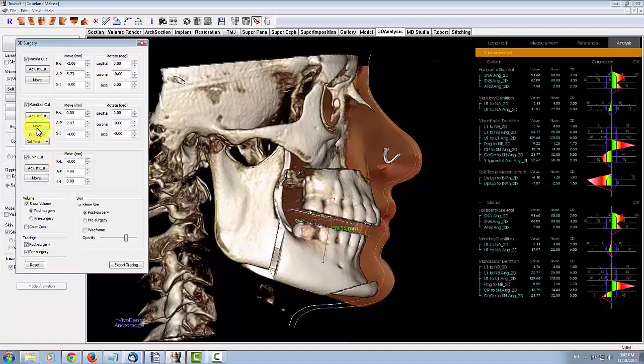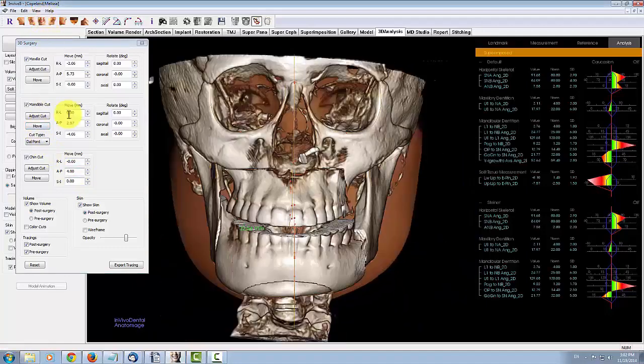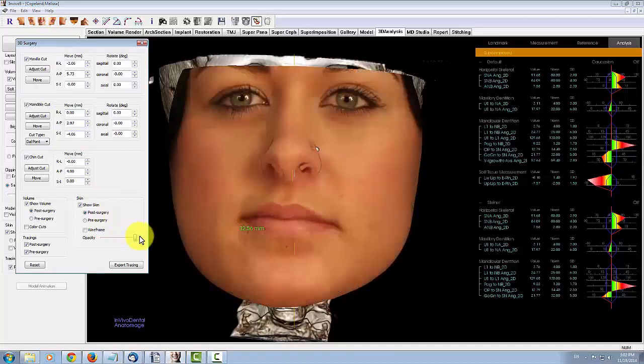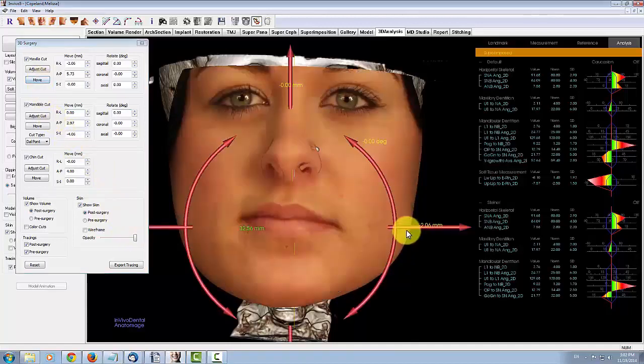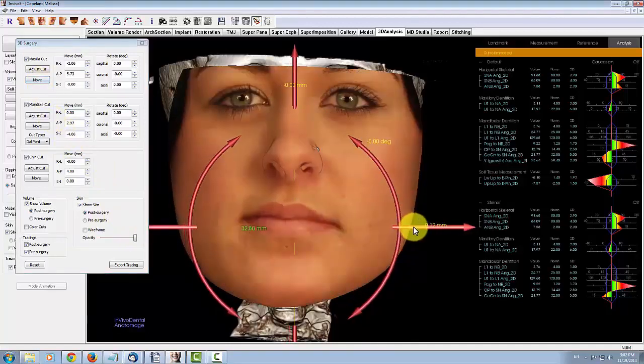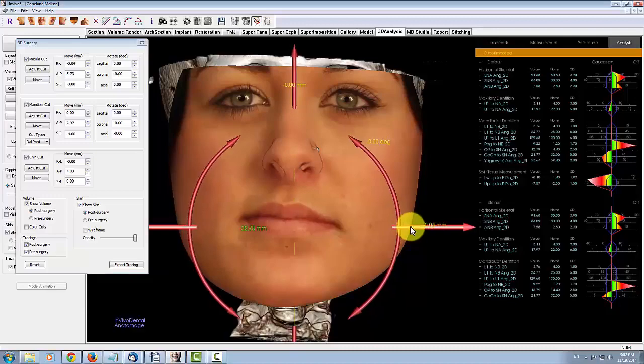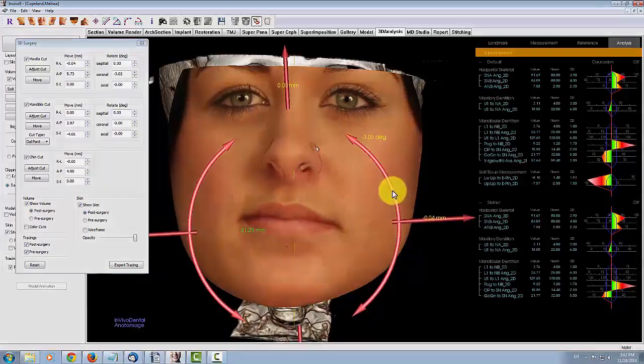You can also use the soft tissue prediction feature to visualize the patient's frontal asymmetry and make surgery adjustments accordingly. Notice how the skin overlay updates in real time for easy visualization of surgery outcomes.